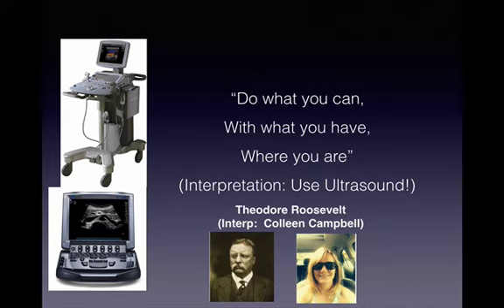And in the words of Theodore Roosevelt, he said, "Do what you can with what you have and where you are." I interpret this as use ultrasound. It's something you can do right away. It's something that you should have at your bedside most of the time, and it will give you an immediate answer. Thank you.